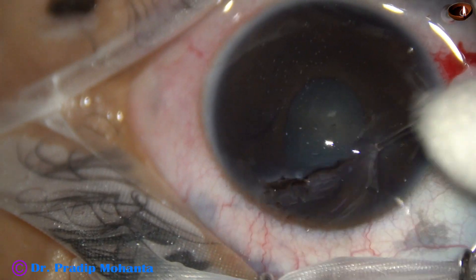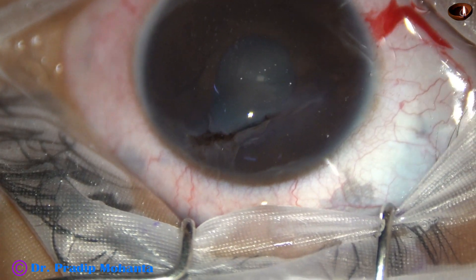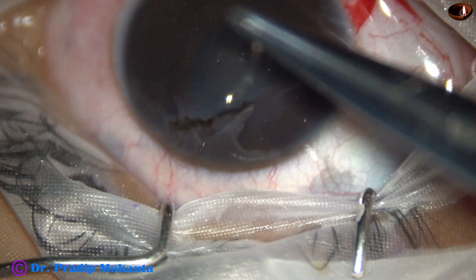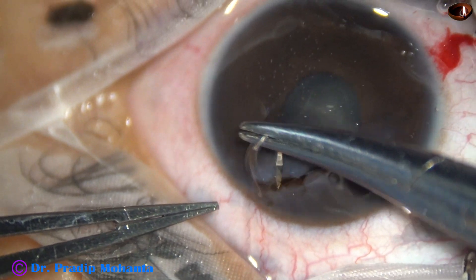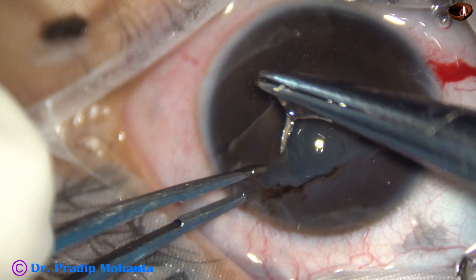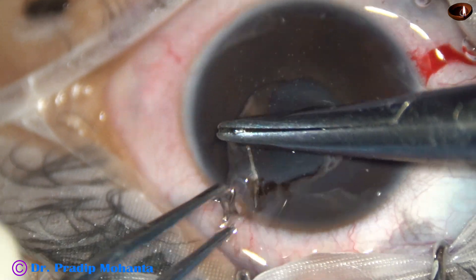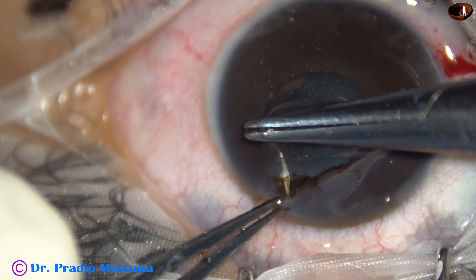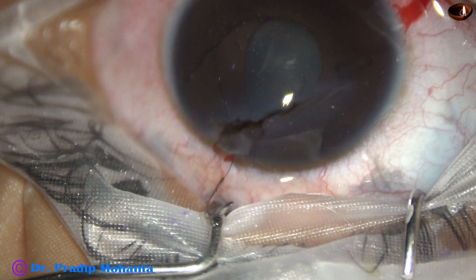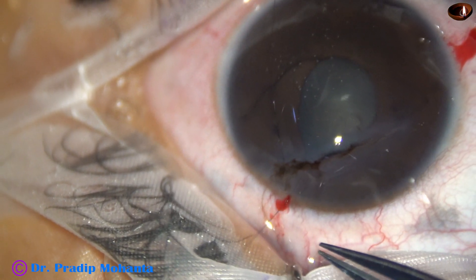I take a fresh 10-O nylon suture, and in this case I thought of doing a shoelace continuous suture, but I found that the wound is not right. So this is going to be an interrupted suture.